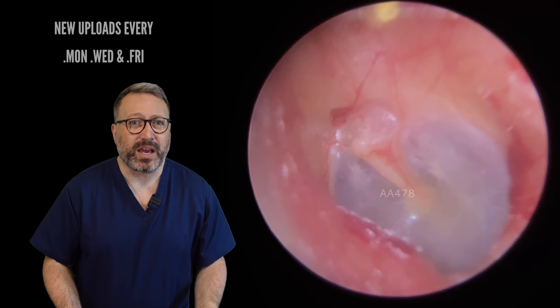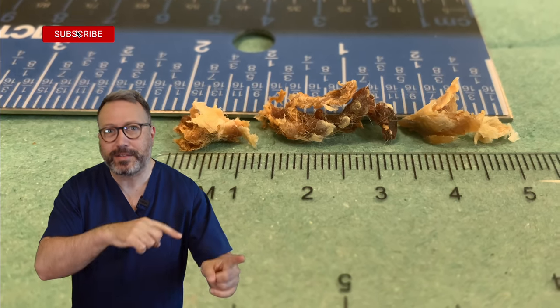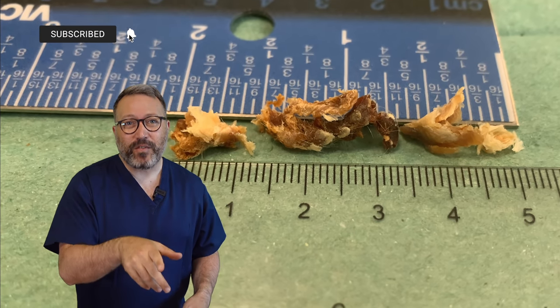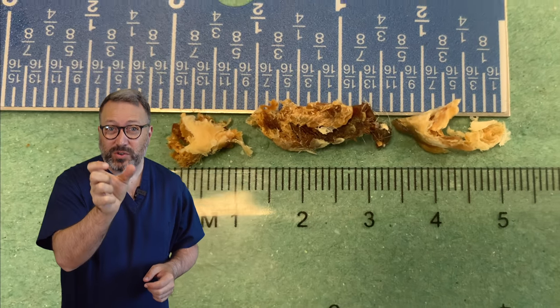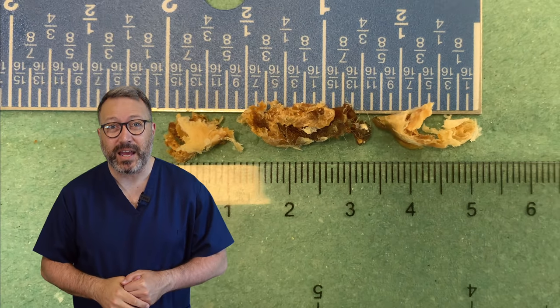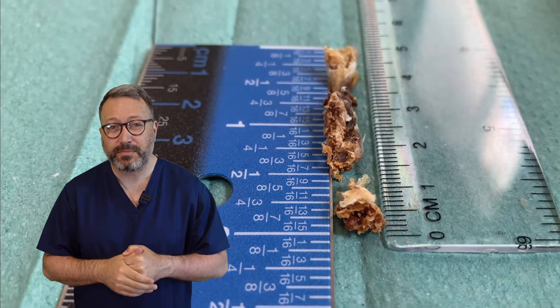That had to come away, and there's no physical bleeding. What's that — five centimetres of wax, two inches? But look at the size of those plugs. That central plug there was the one you saw me pick out from the second ear. Just massive, massive pieces of wax on that side — absolutely humongous.